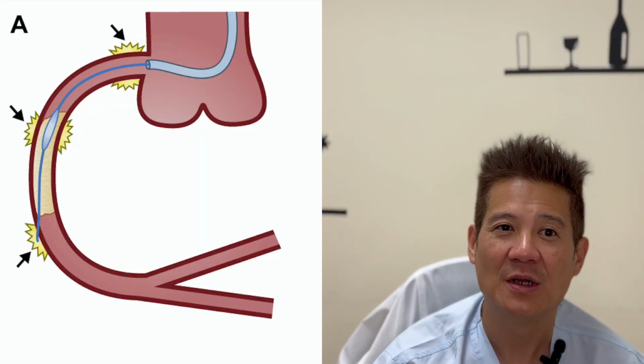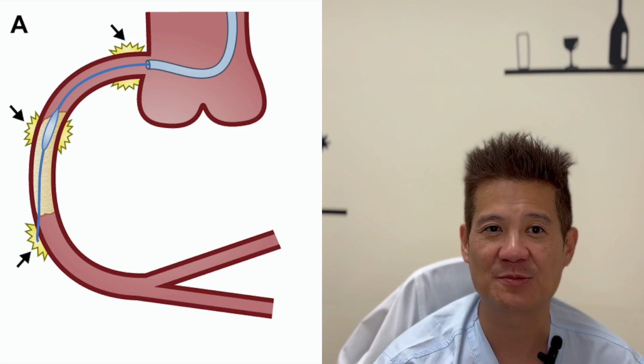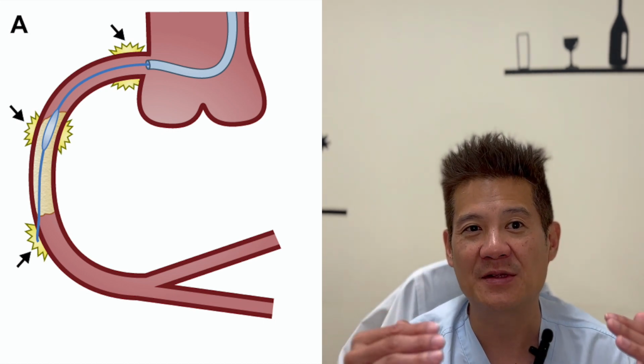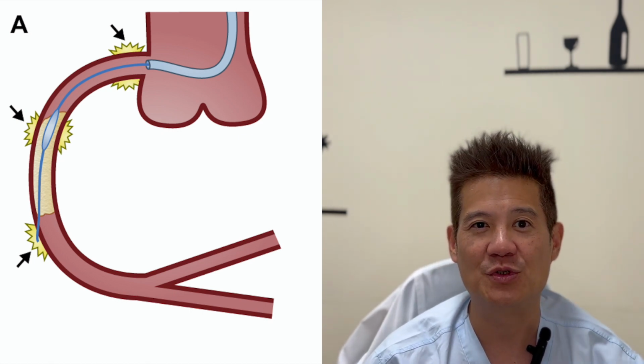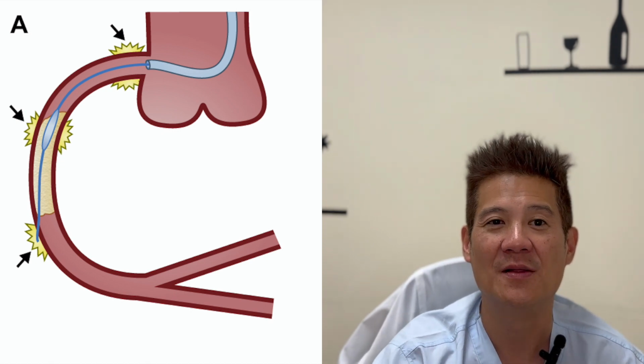Now, the connection between the true lumen and the extraplaque space. Last time we already talked about guide dissection, and that's a common reason for connection between the true lumen and the extraplaque space. Your guiding catheter is too aggressive and it's jammed against the wall and it's dissected the wall and caused dissection into the extraplaque space. If you do injection or the systolic blood pressure pressurizes that, you get a hematoma in the ostium of the vessel.